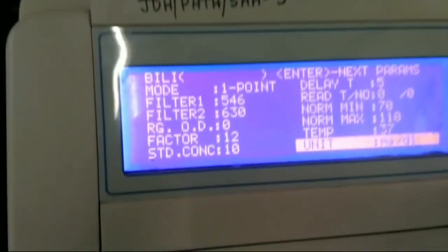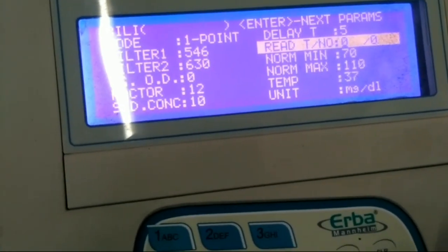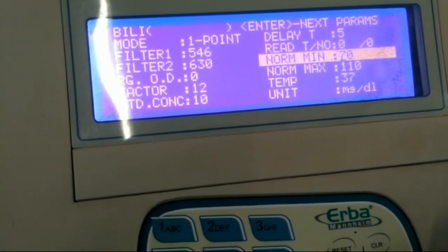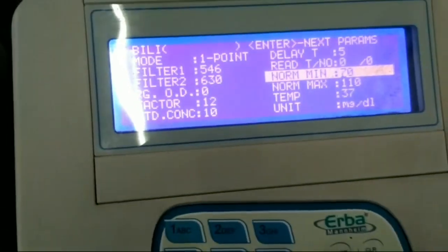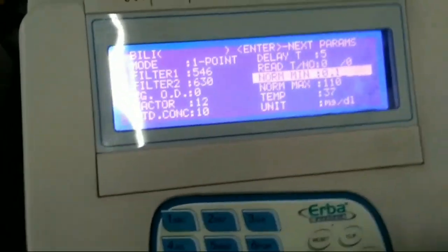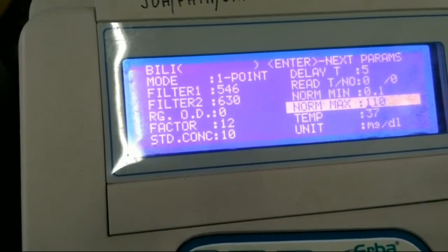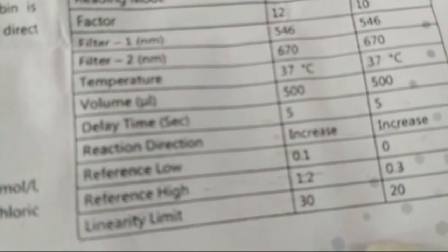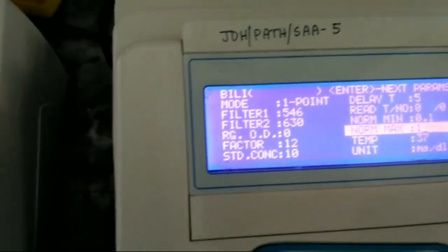The delay time is 5. Then read time — no need to change. The normal minimum is 0.1 and the normal maximum is 1.2 — you have to press 1.2.